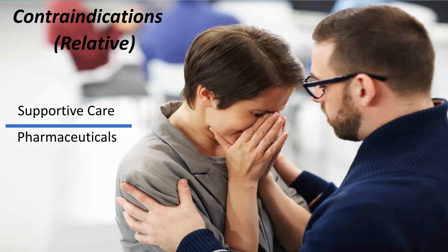Our last relative contraindication is likely to be present in most respiratory patients that we're attending to. It's not necessarily reversible, but it's very treatable and supportable. Anxiety in respiratory patients to the point that you are unable to properly seal a CPAP mask on their face is obviously problematic and a frustrating predicament for EMS because we know that treating a patient's respiratory ailment is likely to relieve a lot of that anxiety. But from the patient's perspective, it's difficult to see that finish line.